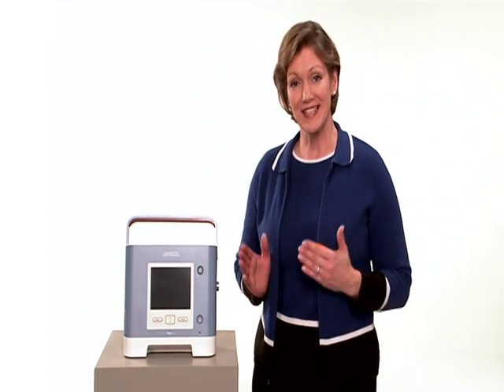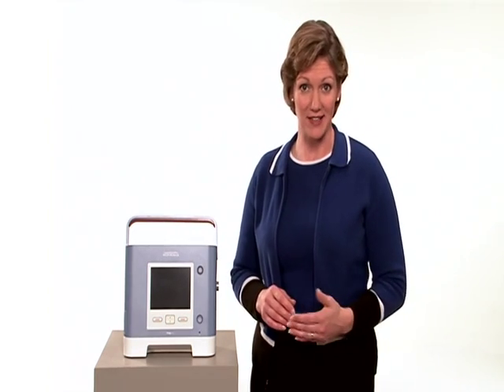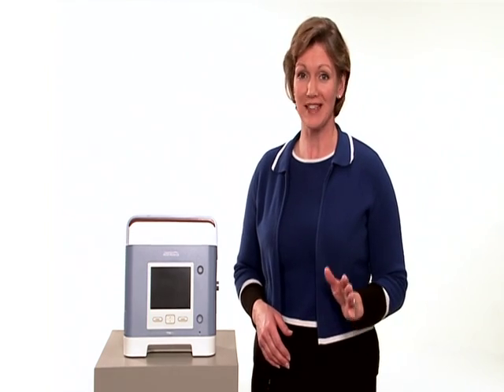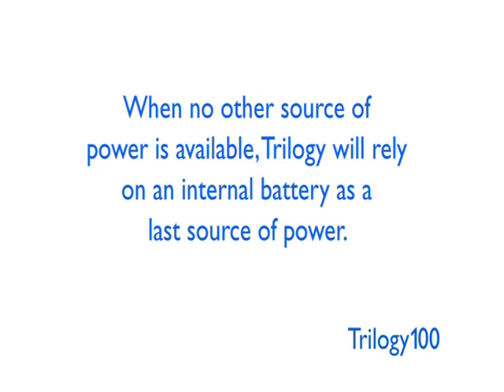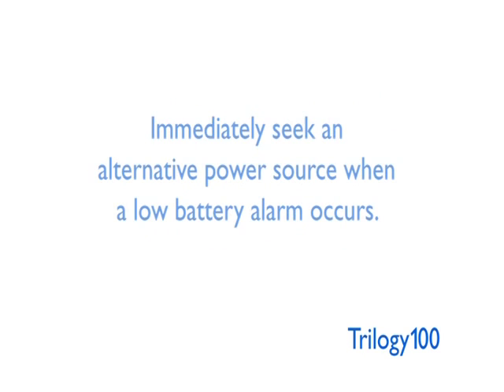When AC is not available, it will run on its external battery if connected. If the external battery loses its charge, Trilogy will run from the detachable battery pack. When no other power source is available, Trilogy will rely on its internal battery as a last source of power. Immediately seek an alternative power source when the low battery alarm occurs, because loss of therapy is about to occur.